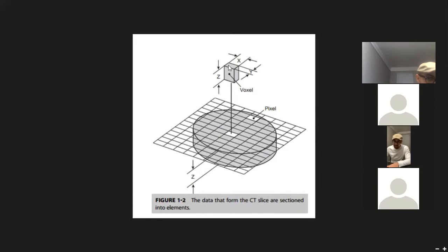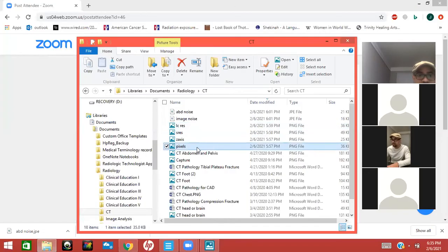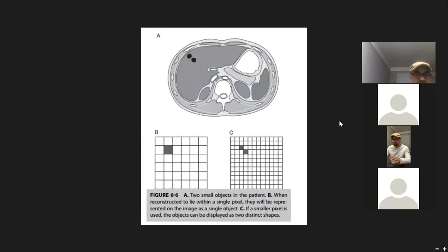So again, we look at Z here. We see that if this was, hold on, I got another picture for you. Oh, what just happened? Don't do that. All right, here's another picture. Well, I'll finish with Z. So, does it make sense, I guess? Let me ask you, does that make sense that the bigger the slice, the lower the spatial resolution in that direction? Just like this picture represents the matrix here. The more dense the matrix, the higher the spatial resolution. Is that part clear for you guys or no?